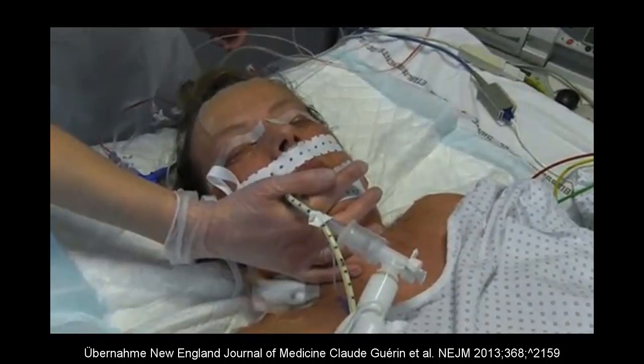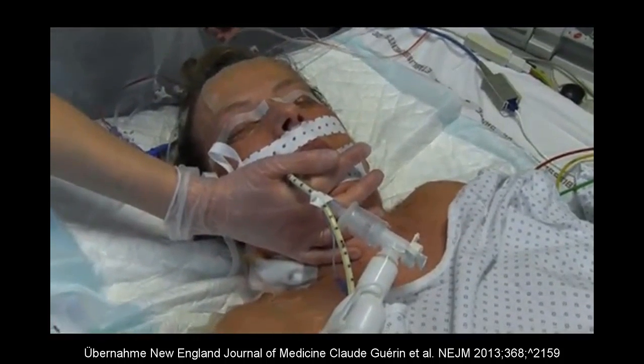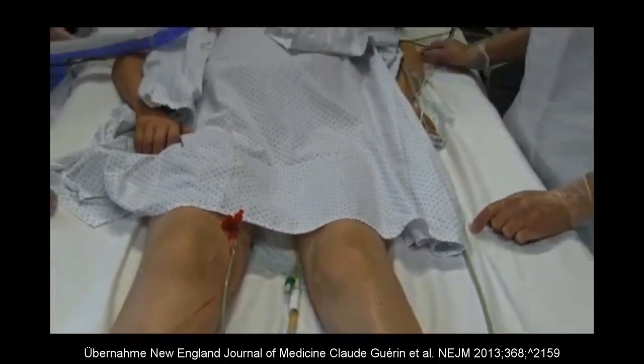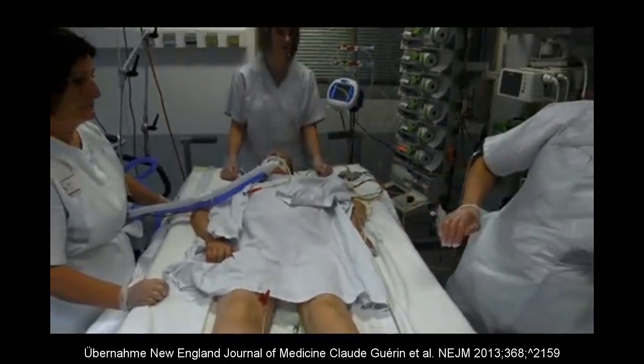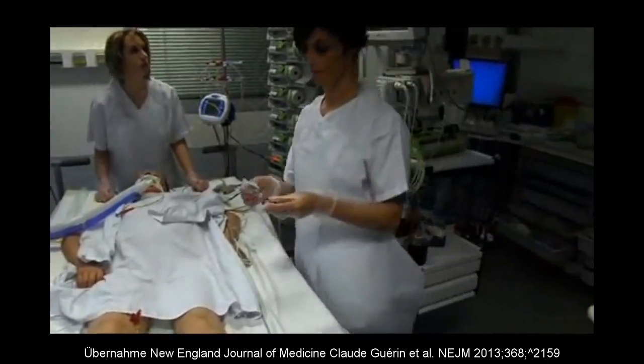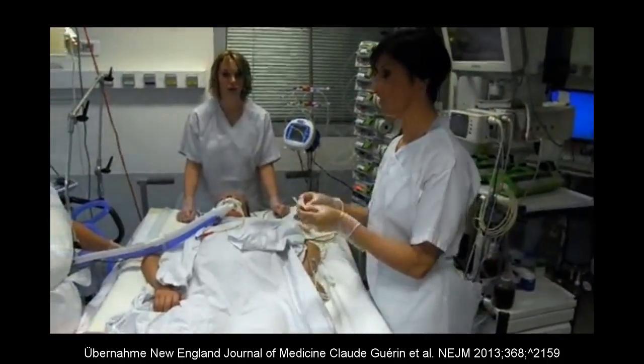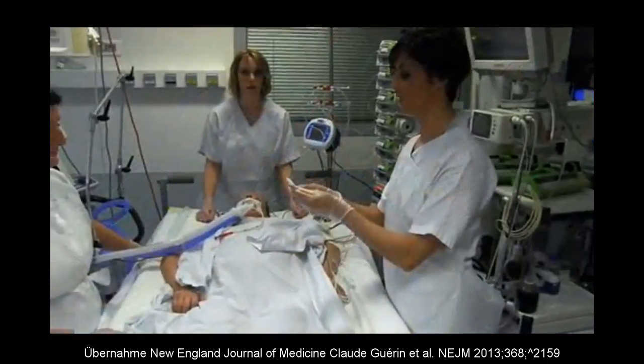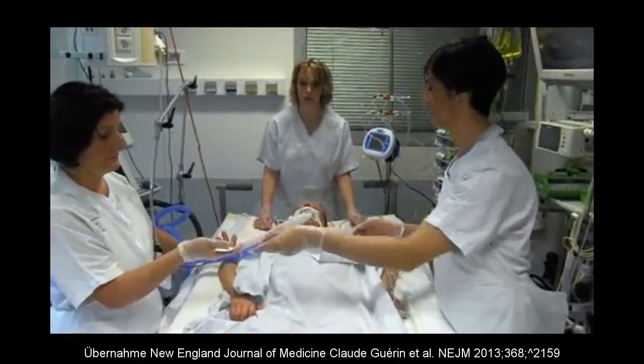Secure the endotracheal tube and the gastric tube. Protect the skin on the forehead, knees, iliac crests, and thorax from pressure sores using adhesive pads. Protect the patient's eyes and get the electrocardiogram electrodes ready for use.